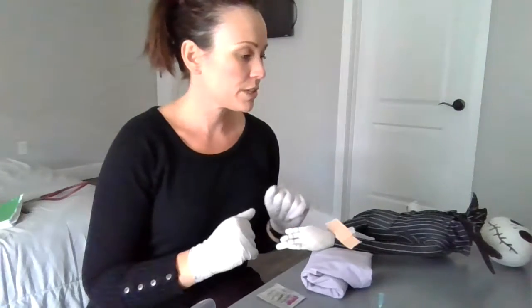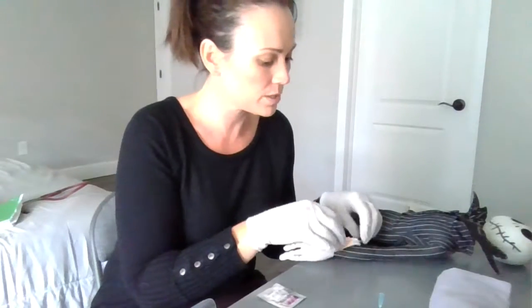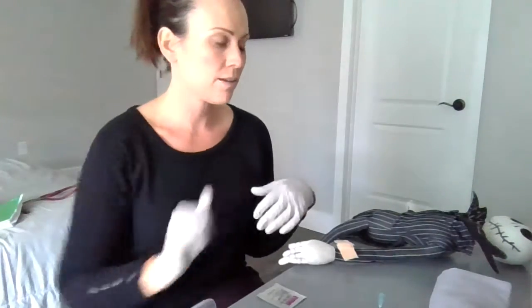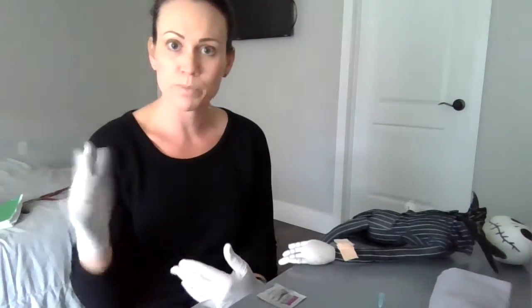Now I'll address the patient. Mr. Skellington, are you comfortable? Thank you for letting me get that sample, and we will be back with you shortly with some results. I'm going to send that off to lab. So I'll take that towel away, making sure the patient's comfortable, that he has his call light in reach. I'll take my gloves off, wash my hands, take the sample with me, and send it off to lab.